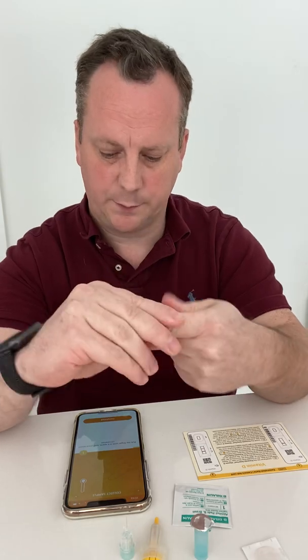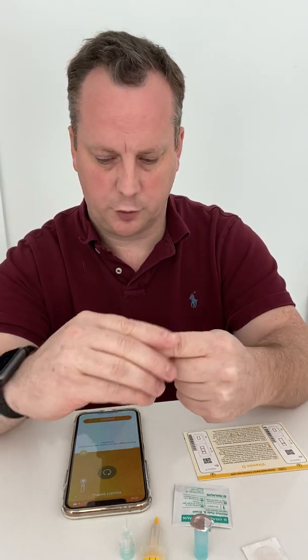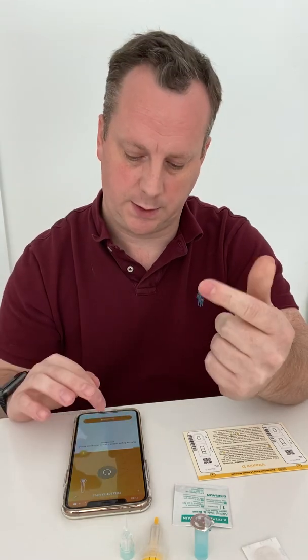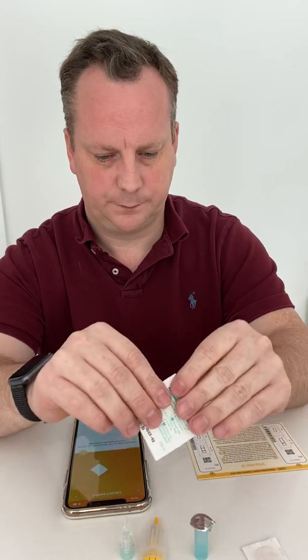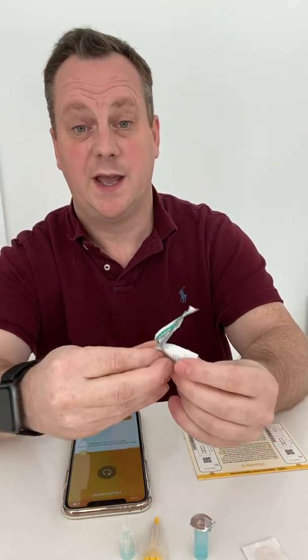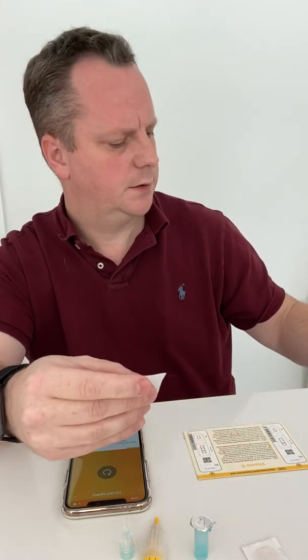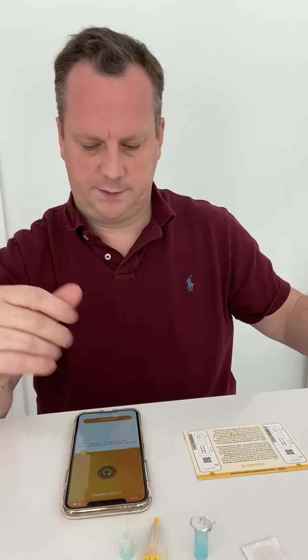First thing it's asking me to do is rub my finger to make it nice and warm, to ensure that I've got good blood circulation. Completed. Clean the finger with the alcohol pad. I'm going to use my index finger today to do this. Fingers are now clean.